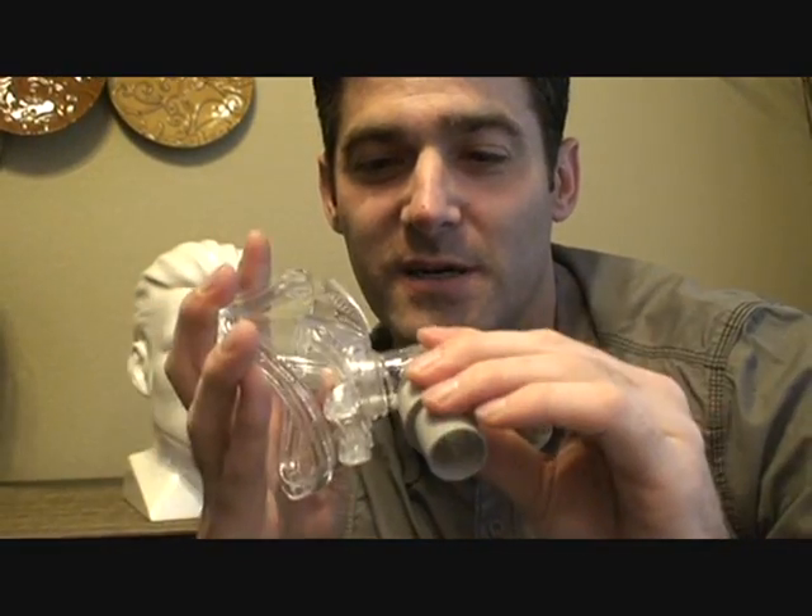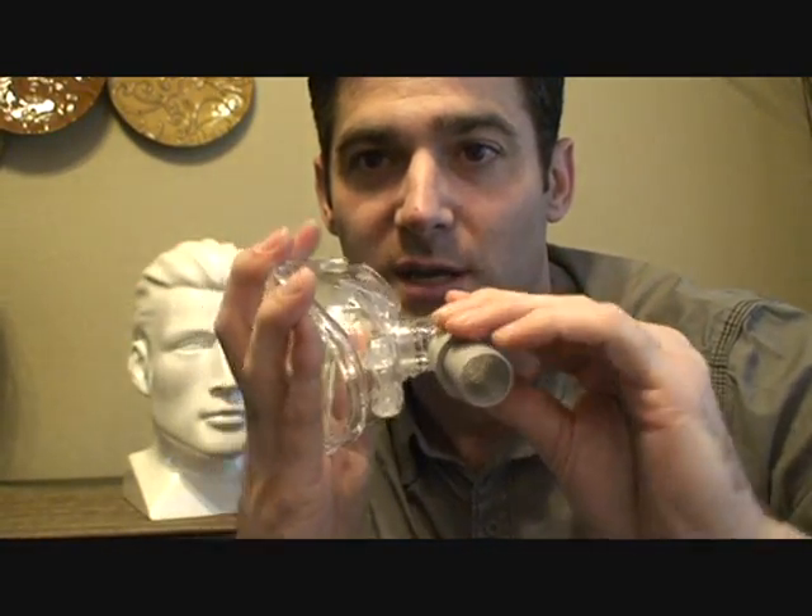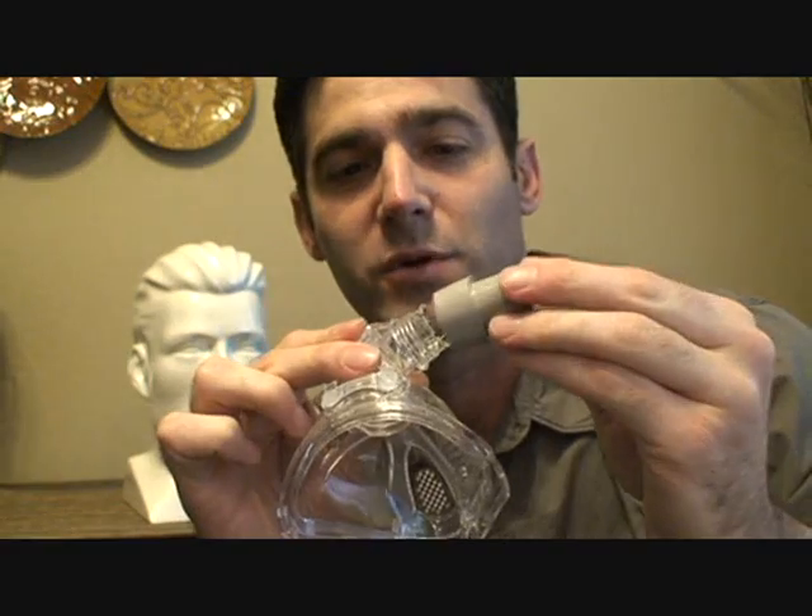It takes a little bit of strength — you push straight in, it'll make a loud pop, and then it'll spin freely and you know it's in. This is just the hose connector, and you can get this part off too theoretically. Pushing it back on is always the easy part.